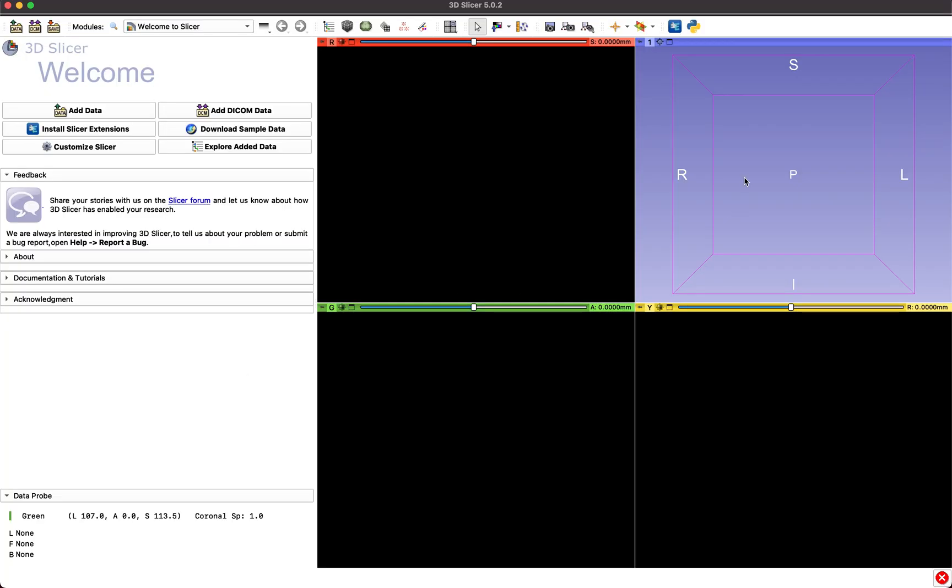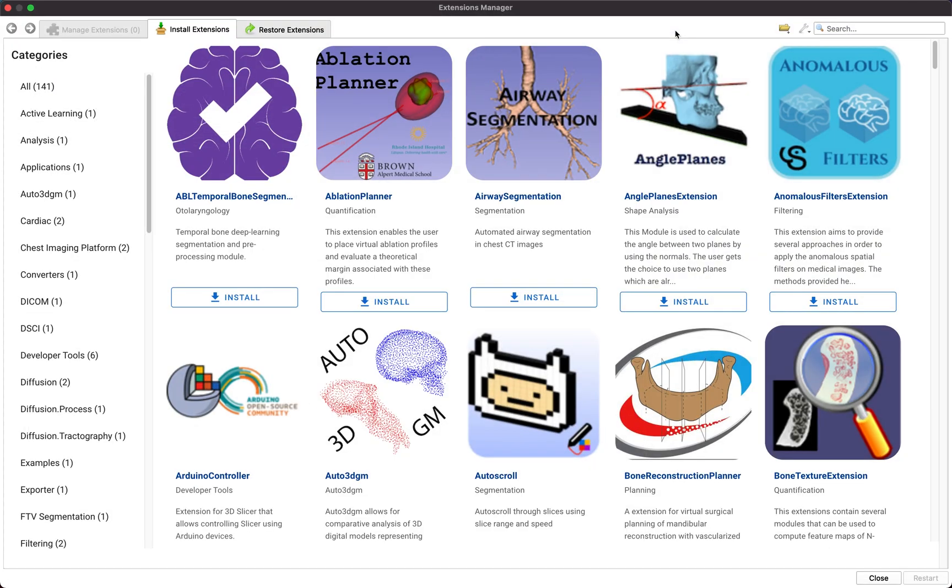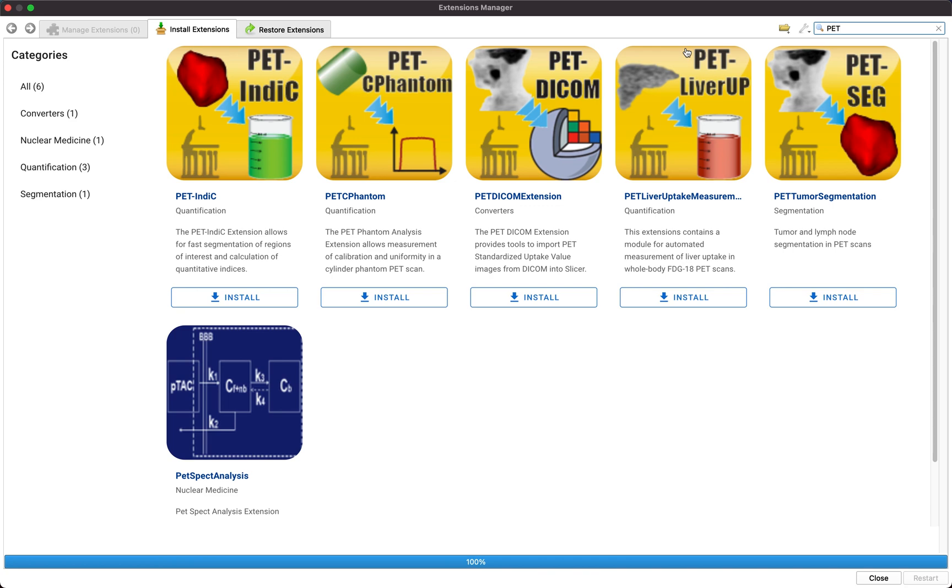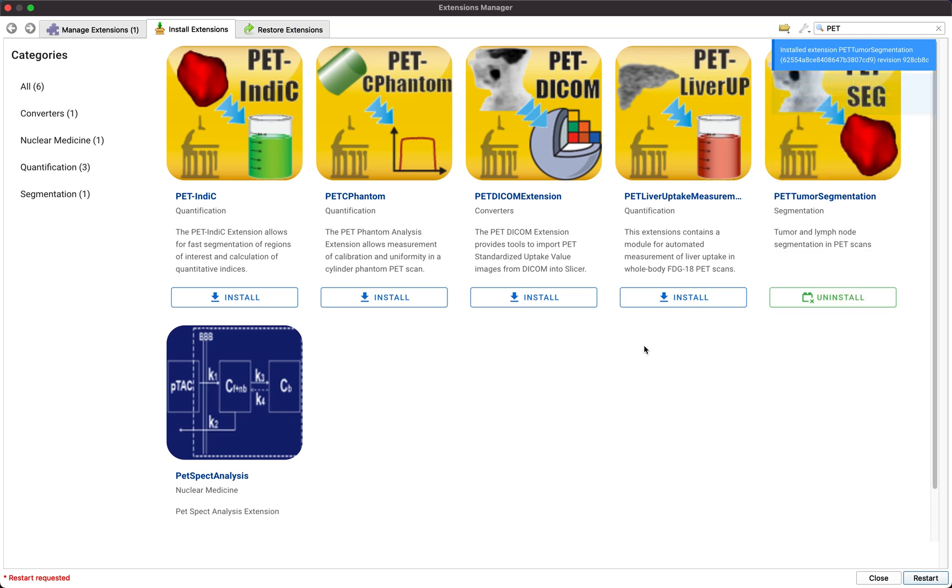From the 3D Slicer main window, navigate to the Extension Manager, then search for the suite of PET tools. The PET Tumor Segmentation Tool is implemented as a segment editor effect and can be used without installing any other extensions.